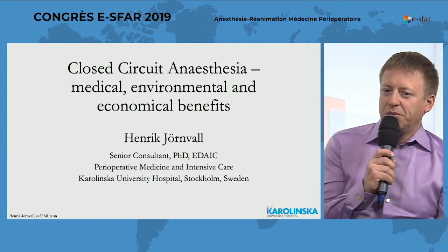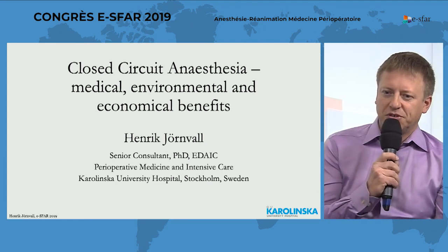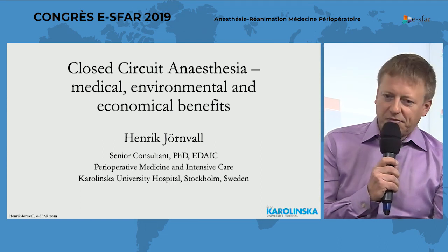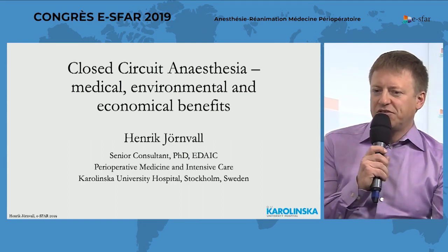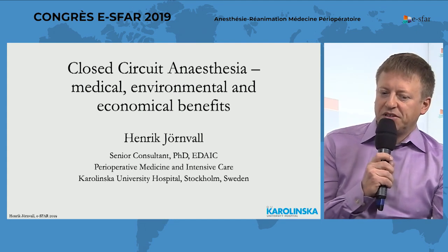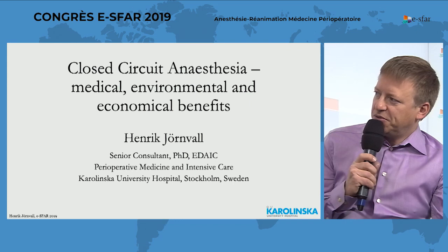Thank you very much. Yes, I can argue that we don't need to reduce the use, but we need to reduce the waste, because most of what we buy, we actually throw directly out in the sink. So what we use, we should continue to use, but we should use everything that we buy instead of throwing most of it out. So I will focus my talk on closed circuit anesthesia, and mostly actual medical benefits, because if you don't enforce or describe the medical benefits, you will never get people to use it.